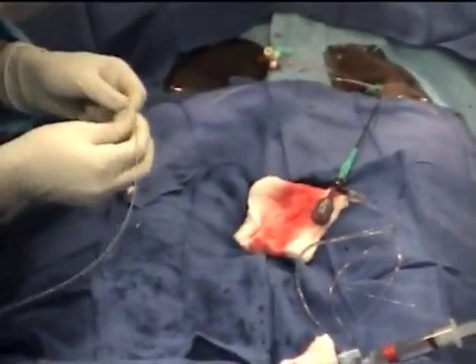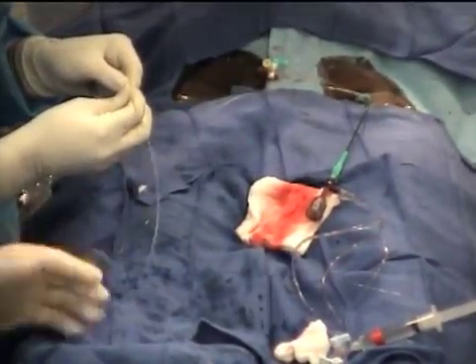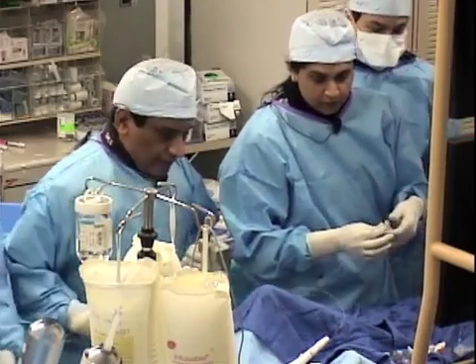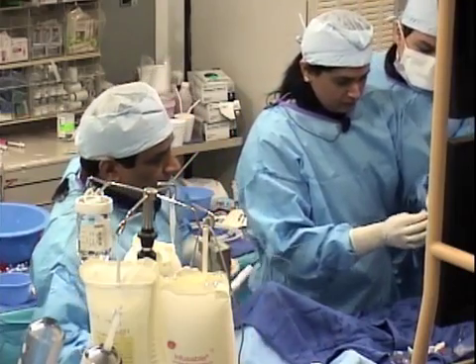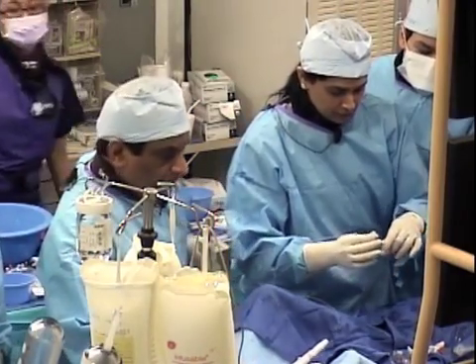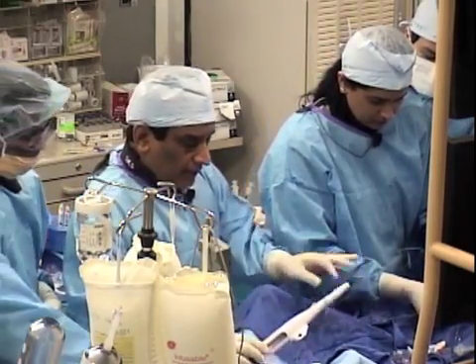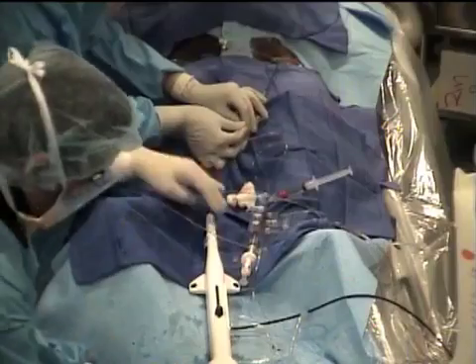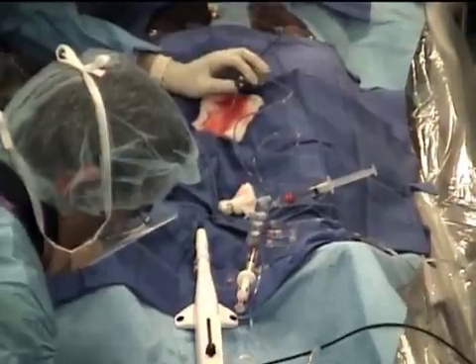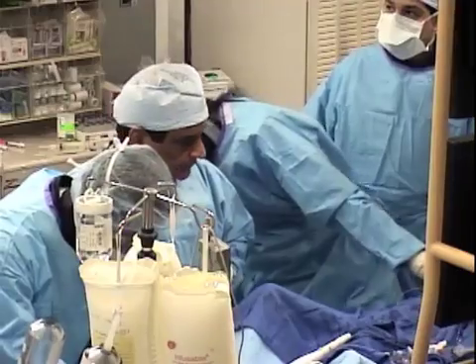Even with your expertise, how much of an angle will you never do with the rotablator? Well, sometimes with some of the calcific angulated lesions, there is no other choice, you need to do rota and then just use a 1.25 burr. If we can avoid rotational atherectomy on angulated lesions, let's say 180 degrees, with tortuosity proximally, we do. But otherwise, if the angle itself is calcific, the only way you can do it is by rotational atherectomy. So those would be the cases where you would further undersize the burr. Absolutely. Good.